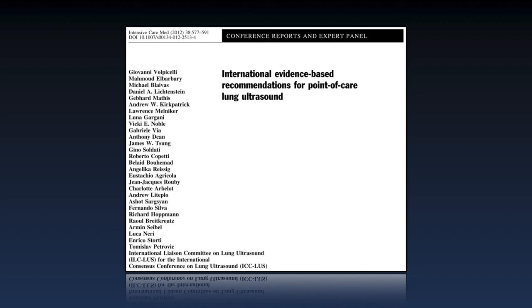We see a wall. We see the fluid in the gallbladder. We see the stones in the gallbladder. We see the findings of cholecystitis. Same thing if we look at a FAST exam, right? We're looking at free fluid around the kidney, around the liver, around the spleen. We're actually seeing the pathology, and we're able to make some pretty decent decisions off of that. What makes lung ultrasound different is the fact that we're looking at artifacts.